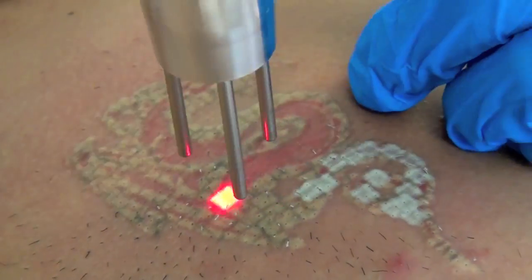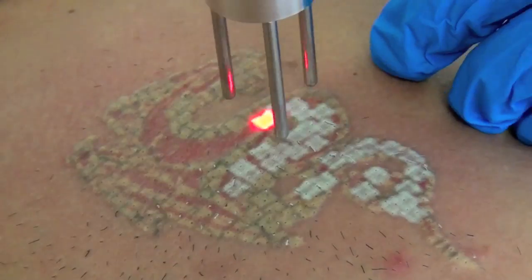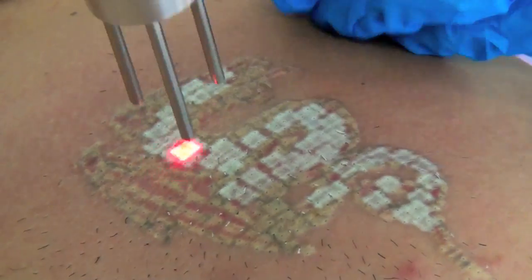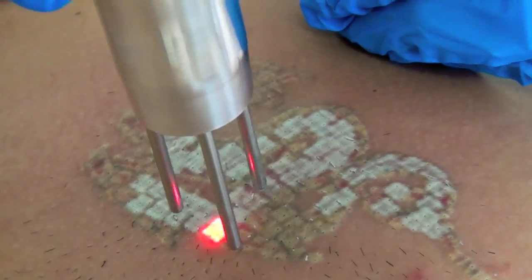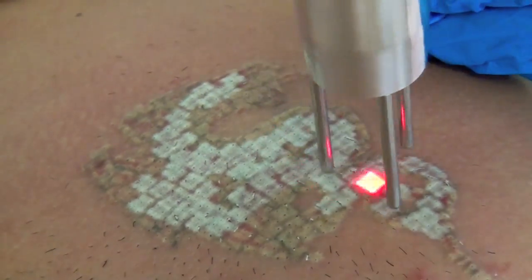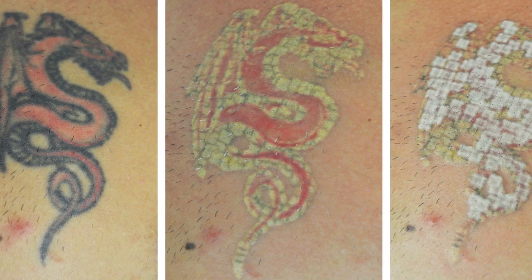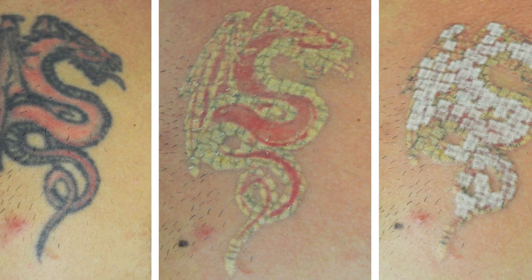Now we've switched to the Duality's powerful 532 nanometer wavelength to target the red ink in this tattoo. Together, the dual wavelengths of the actively Q-switched ND-YAG Duality system can treat virtually all tattoo colors effectively with outstanding results. You can see the Duality's excellent reaction on this multicolored tattoo.